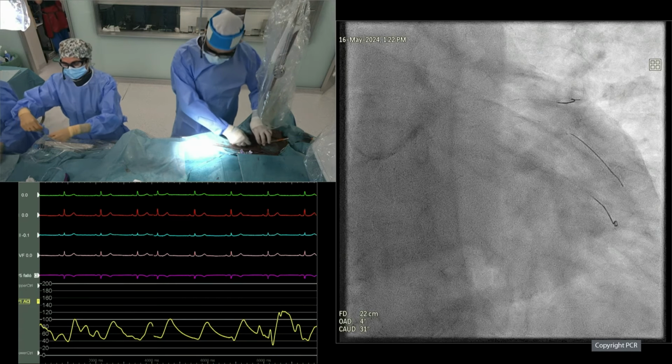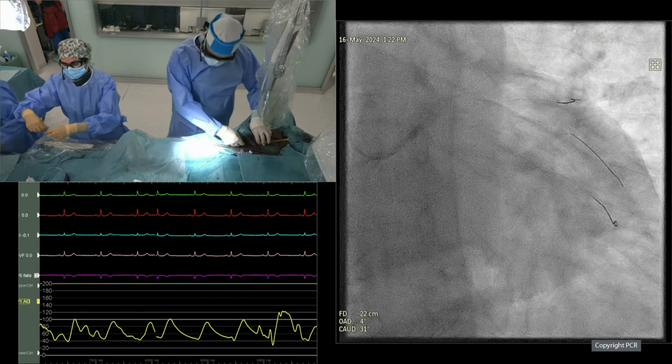I think it's important. I would like to see imaging now, because the most important thing and why we did this PCI was to achieve an optimal stent expansion in that ostial circumflex. So I would like to see a nice MSA there. If I see that, then I would depend the rest of my steps on the angiographic appearance of the LAD, especially because the marginal just needs to flow, and the LAD should not be too pinched. If the LAD is pinched, then I would kiss. If the LAD is not pinched and it has a TIMI 3 flow, patient is asymptomatic, I would end the procedure with an optimal stent expansion at the ostium and an apposed stent in the left main.